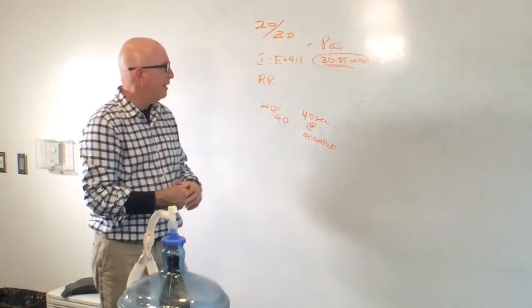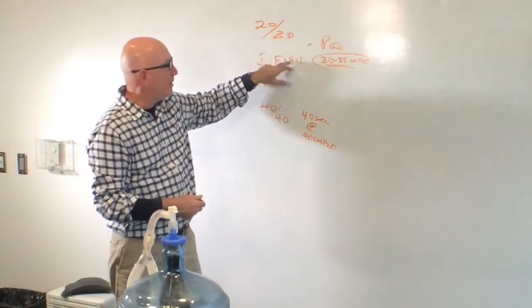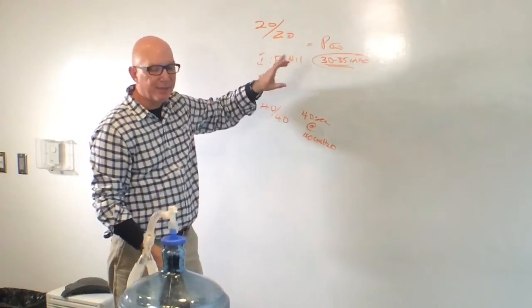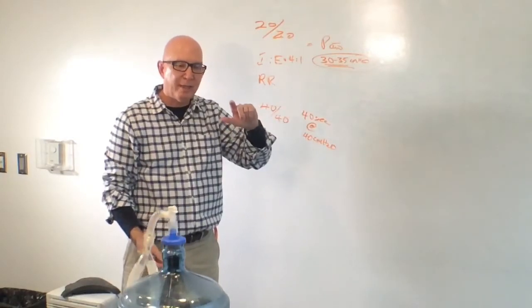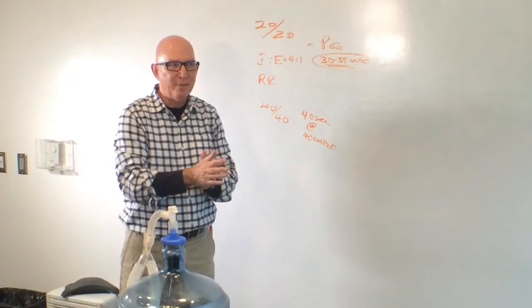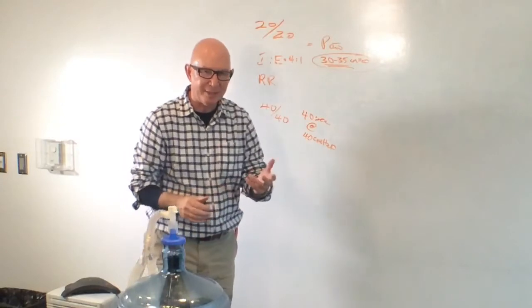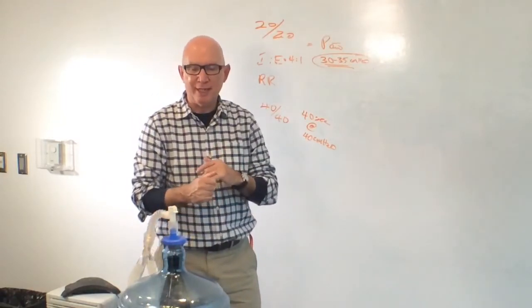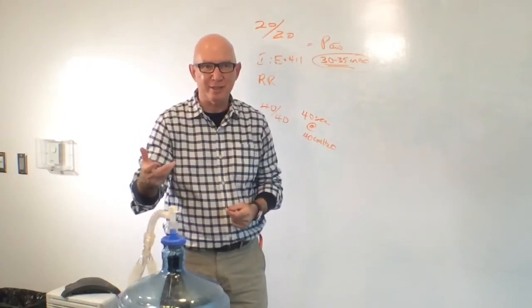Essentially, this particular maneuver is one that's performed in the literature with pressures higher than we use in Ornge, and used effectively. In fact, it's been about 1.5 years now since it's been part of our strategies within Ornge, using it with the LTV. It was a few weeks after we performed the CME that one of the individuals in the north said, we just had a patient who we performed a recruit maneuver on, and it was amazing because it actually worked, and they had an increase in saturation as a result.